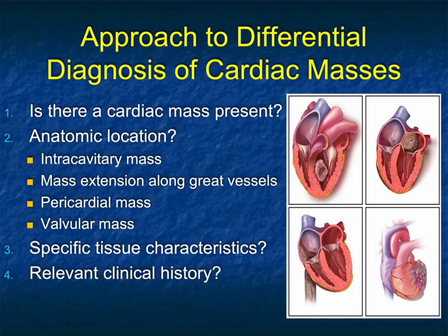However, it's not uncommon for us to see cardiac masses. And so it's important to really think about them, understand their CT appearance, and understand a little bit about history and how we go about analyzing these cases.